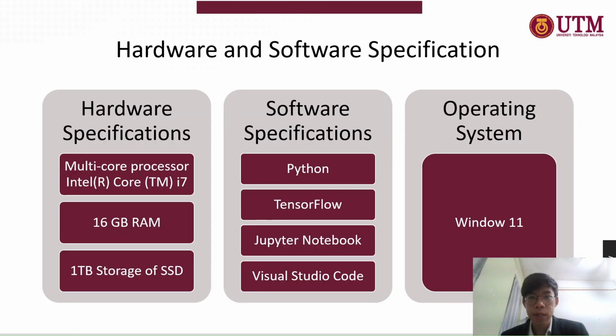I would like to present on the hardware and software specification that I utilized throughout this whole research. For hardware specification, I utilized a multi-core Intel Core i7 processor with 16 GB RAM and 1 TB of SSD storage.